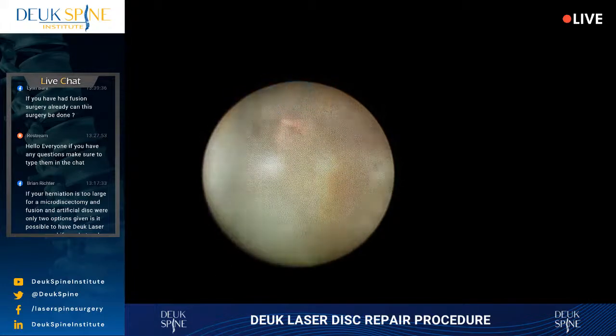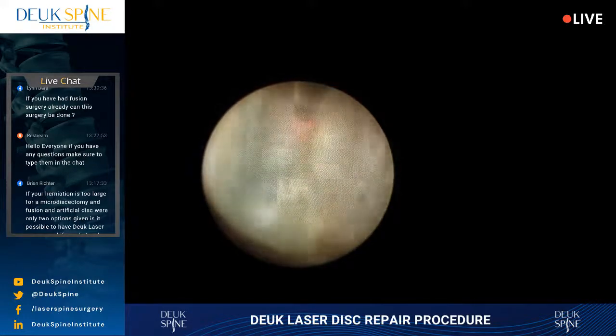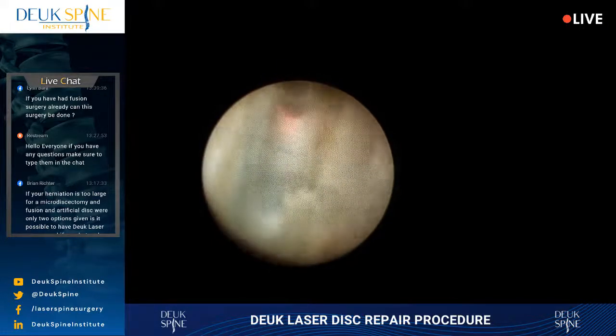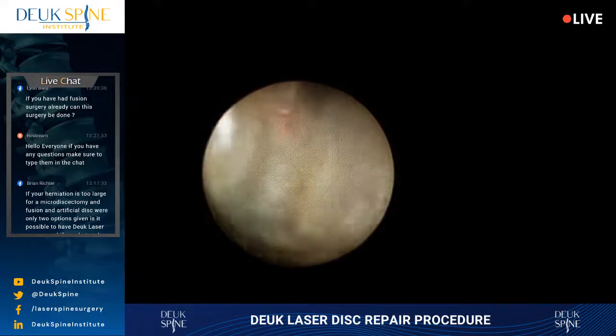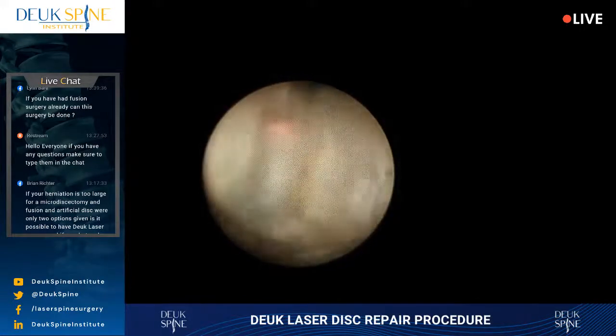We have a question from Facebook. Sure. Has this patient already had fusion surgery? This patient has already had a fusion, yes. I did not do it. It was done in Texas where they live. And I think they regretted doing it. And now she has problems above her fusion, and she did not want more fusion.